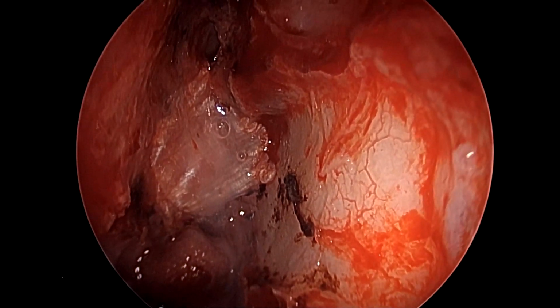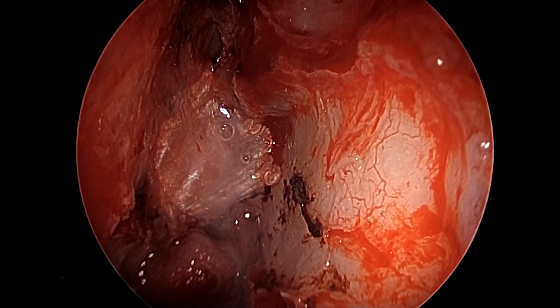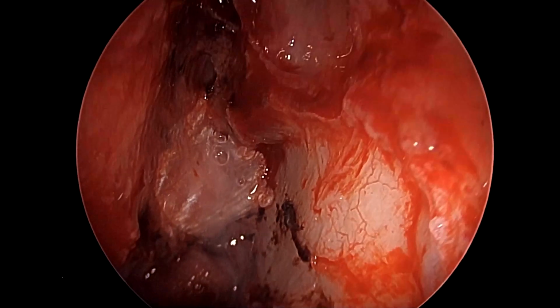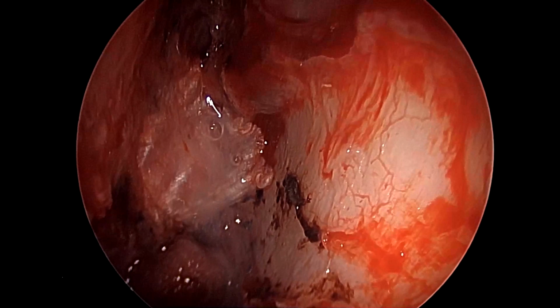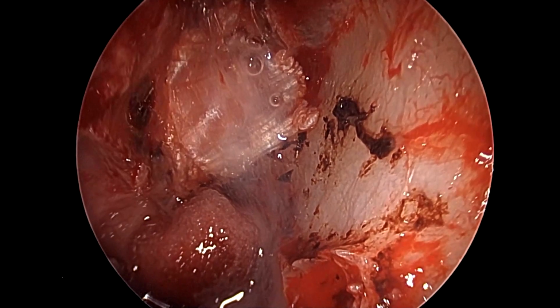So as we have given some time for the tissue glue to set over our fascia graft on the bone, we can now begin placement of some gel foam layers over this assembly to help it in setting.